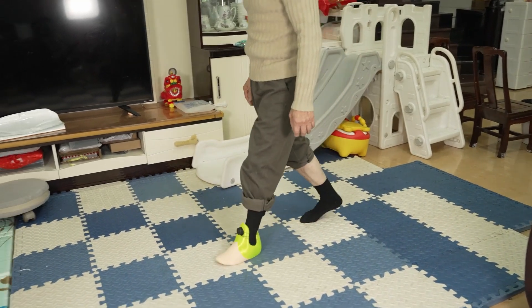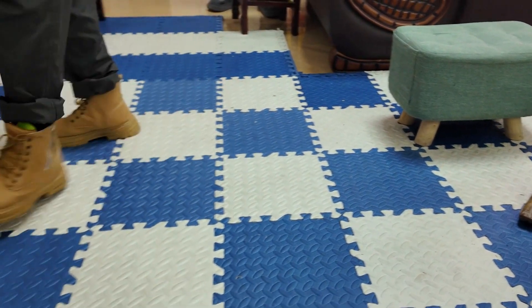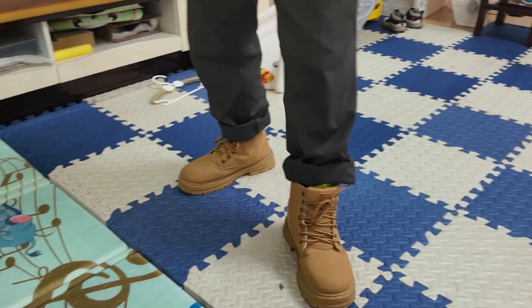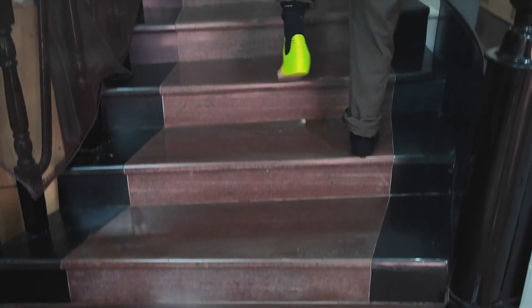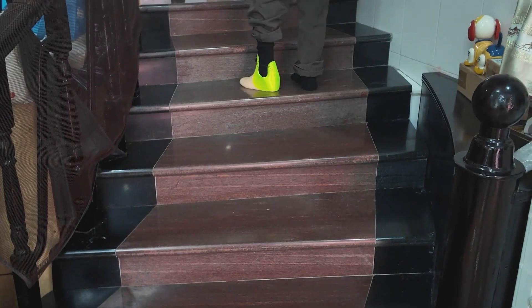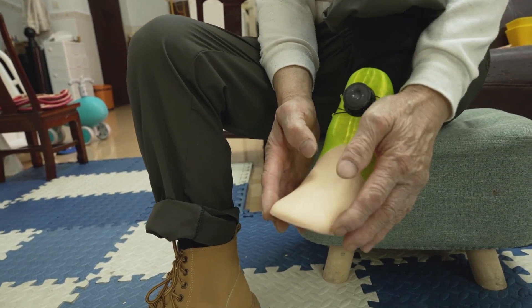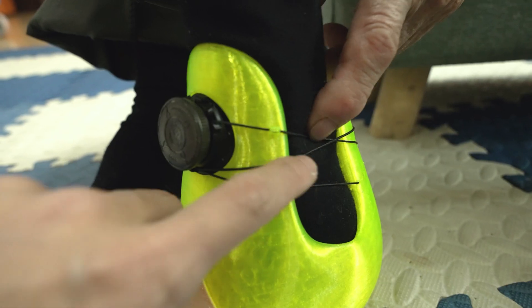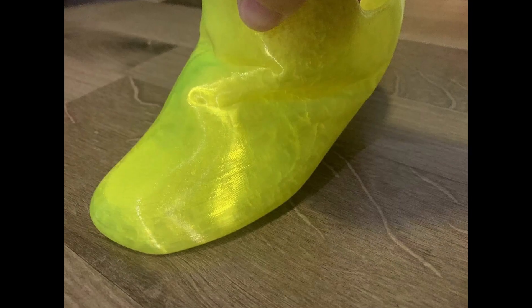But foot V1 is still not quite perfect. While walking without shoes indoors, the bottom is a little slippery on the floor and it's a bit narrow — not very stable when standing and walking. Also, the strap hurts a bit on the Achilles, and the top of the overall prosthetic is still too hard. What's worse, after about a week the structure collapses.